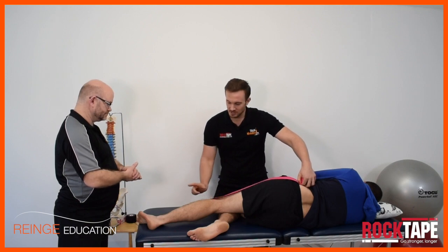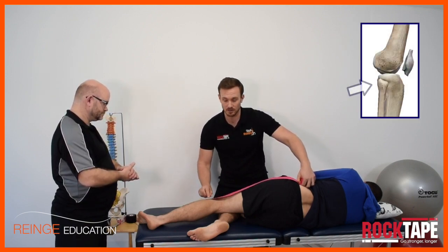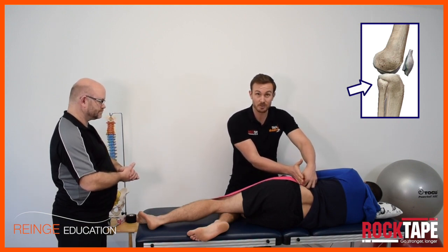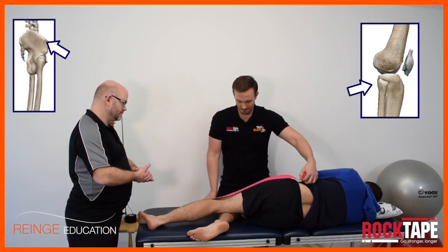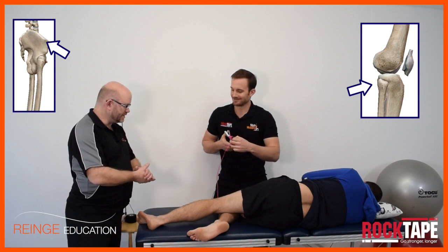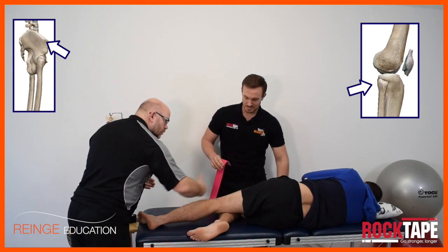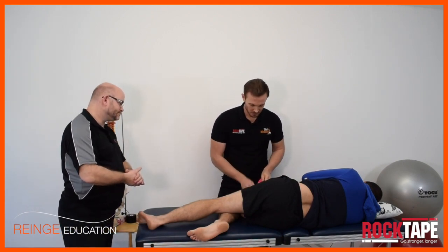I measure the tape from the head of the fibula — just as an anatomical reference point — up over the top of the pelvis, over the top of the iliac crest, so it comes out the top of their shorts. That's going to presumably provide some decompression and some proprioceptive stimulation across those two points where we could get the rubbing and the pain.